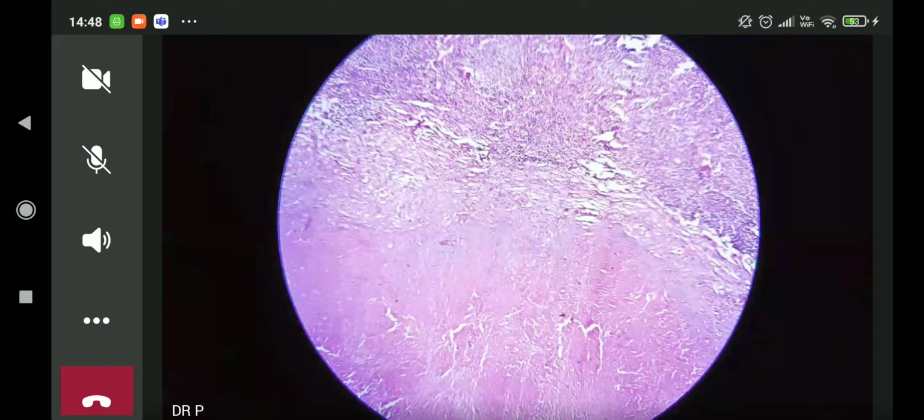Now, if you look carefully, you have certain collections over here. This is something that has not been taught to you in the lectures till now, but since I can see this and I want you to know and understand what is going on, I'm going to teach you this. So, this is the lymphoid area, right? Previously, I had shown you that in the interface, we had fibroblasts. Now, this is something new.